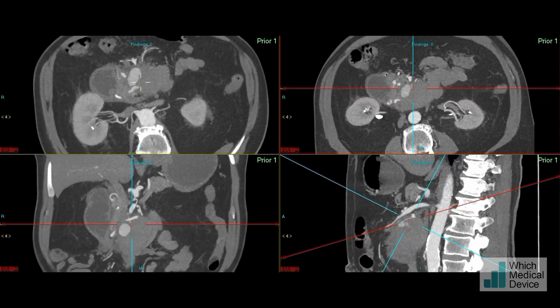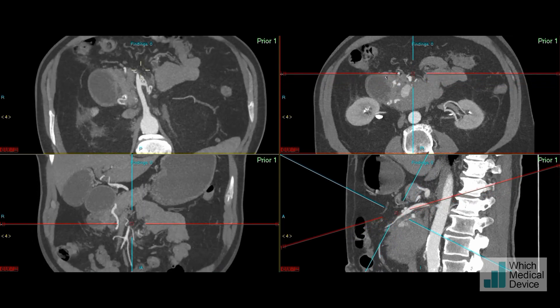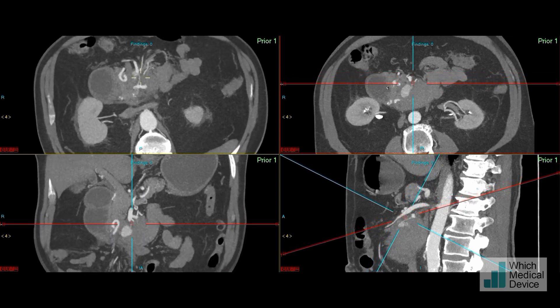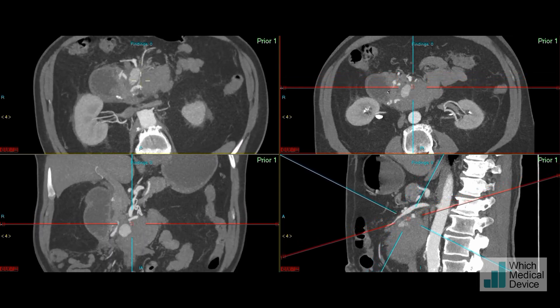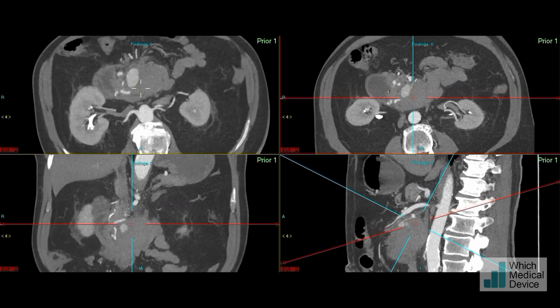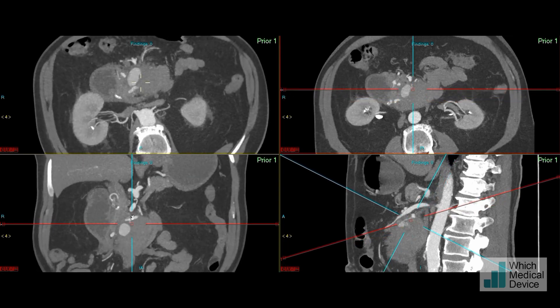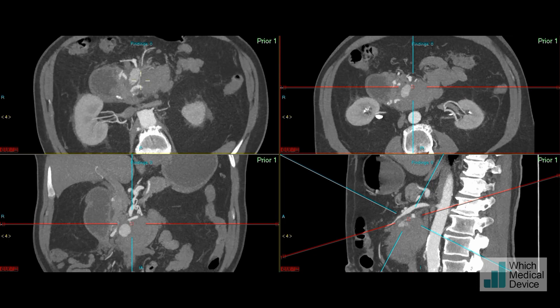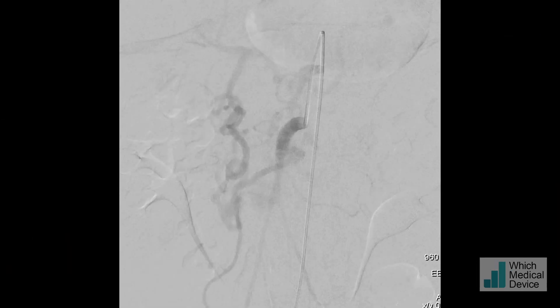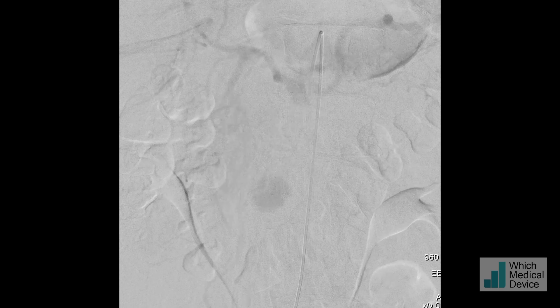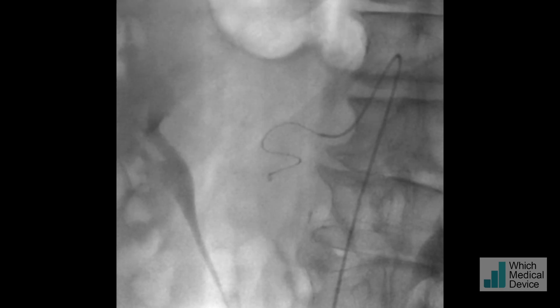Looking at the coronal oblique, we're anterior — there's the SMA — coming posteriorly, there's the pseudoaneurysm, and there's the inferior pancreaticoduodenal artery that this is actually coming off just here. This is a SIM2 catheter placed in the SMA, and look at the rapid flow via that inferior pancreaticoduodenal artery — you can see the pseudoaneurysm faintly filling.